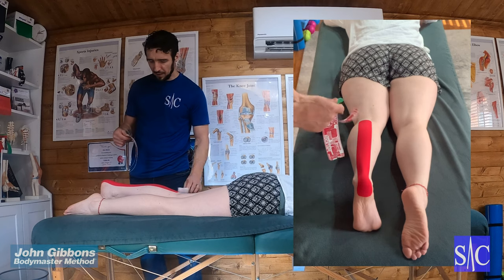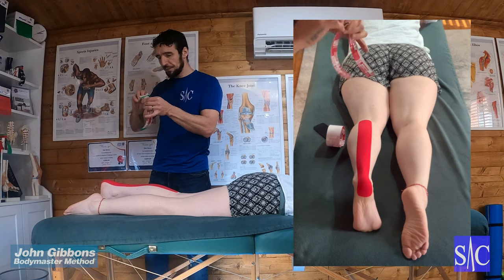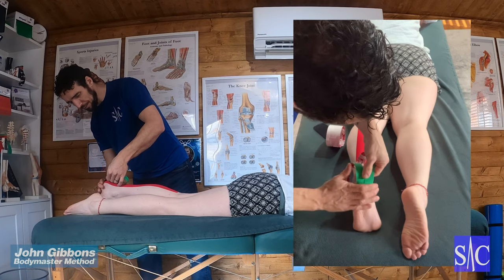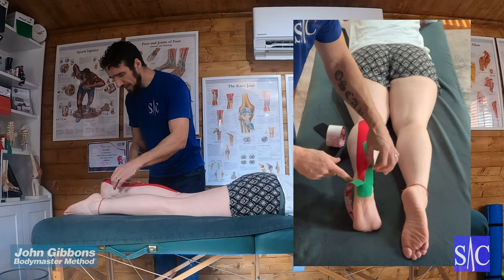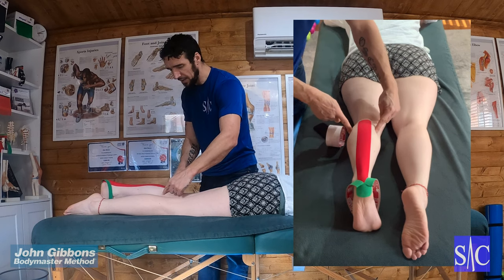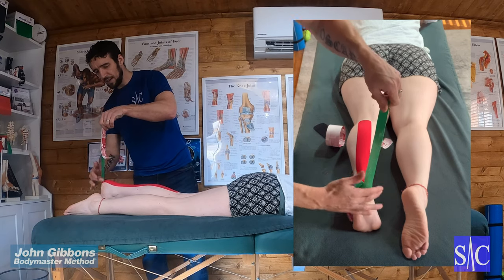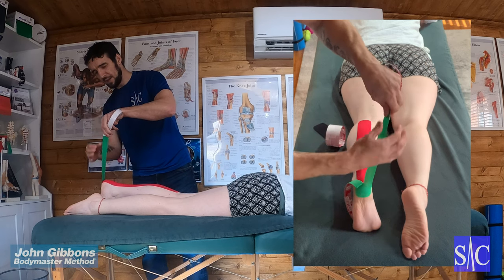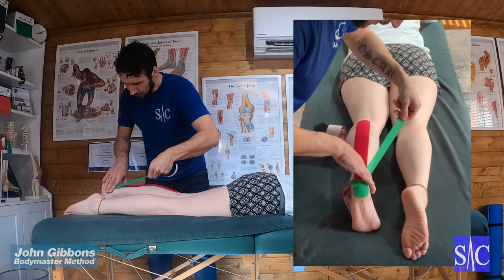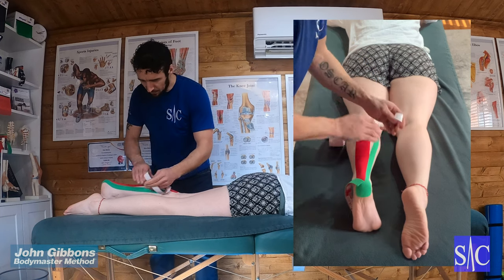For the second piece, take off the inch at the end, leave the two legs with backing on, and apply that straight over the first piece. Bring the legs up, coming between the tendon and the ankle bones, hugging the outside of the calf up to the top. We want about 75% stretch — pull until the backing comes off, hold the end at 100%, then back it down to 75%, between the tendon and the ankle bone, round the side of the calf, and then up. At the end, no stretch at all.